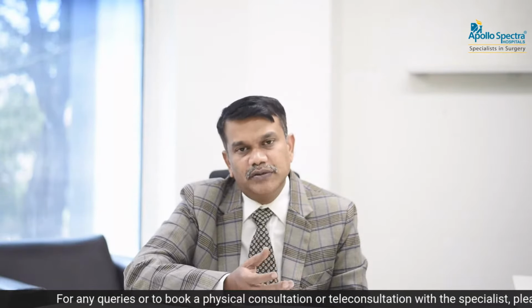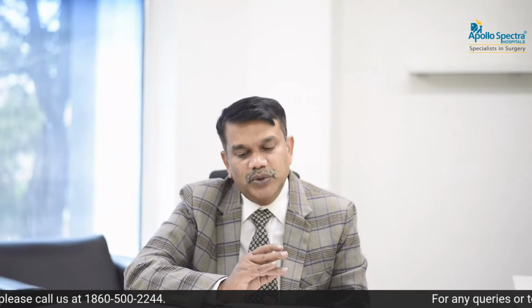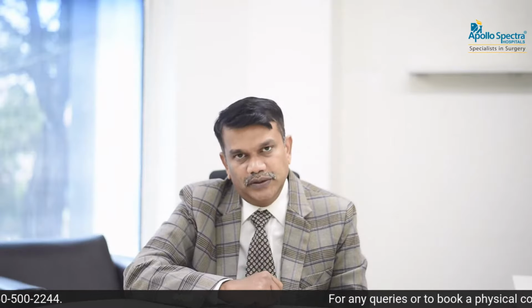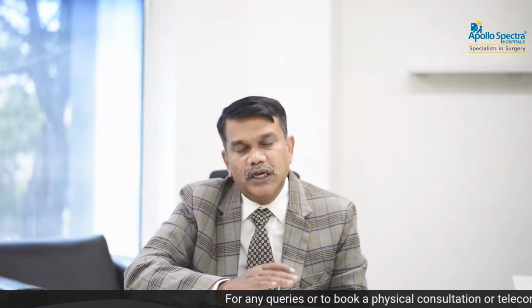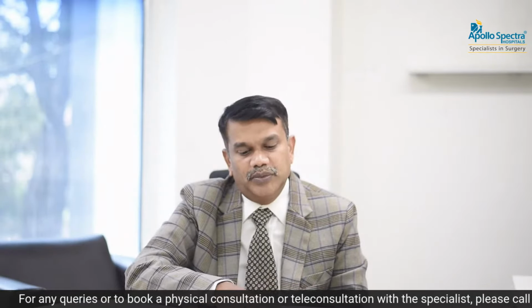So why IPOM plus? There is less chance of seroma formation. Seroma means fluid collection within the hernial cavity or sac cavity. There will be no mesh eventration. Eventration means when IPOM plus is done, the mesh cannot go into the sac. There is less chance of recurrence and better restoration of abdominal wall function. And the last one is improved long-term outcome. So we prefer IPOM plus as a better technique than IPOM.